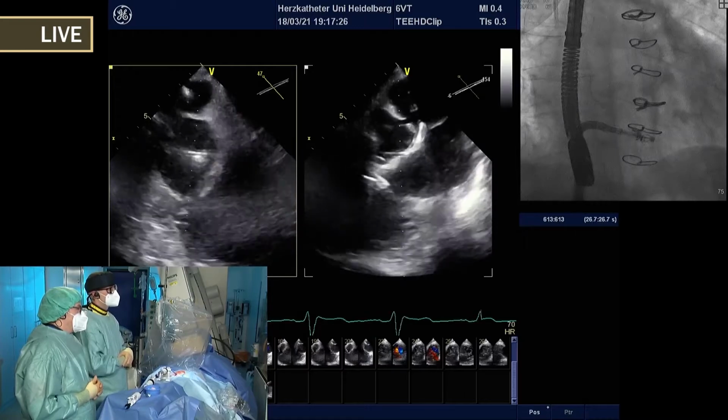Yeah. So Peter, do you often use this leaflet optimization? Or is this something exotic, this maneuver? No, I think it's exactly what the last point is quite important. As you have the septal leaflet is very difficult.